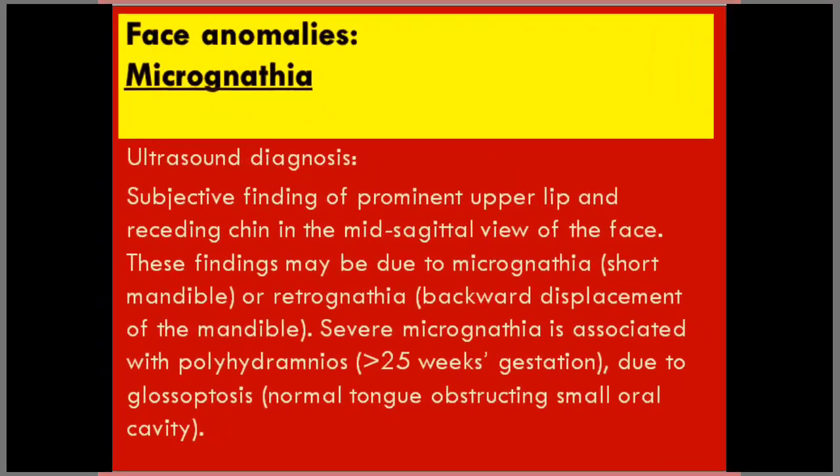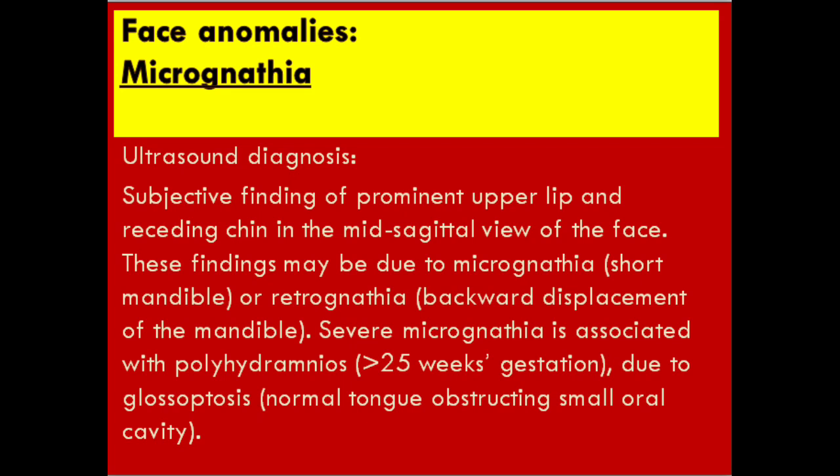The next is micrognathia. Ultrasound diagnosis: subjective finding of a prominent upper lip and receding chin in the mid-sagittal view of the face. These findings may be due to micrognathia — a short mandible — or retrognathia — backward displacement of the mandible. Severe micrognathia is associated with polyhydramnios after 25 weeks gestation, due to glossoptosis, where the normal tongue obstructs the small oral cavity.